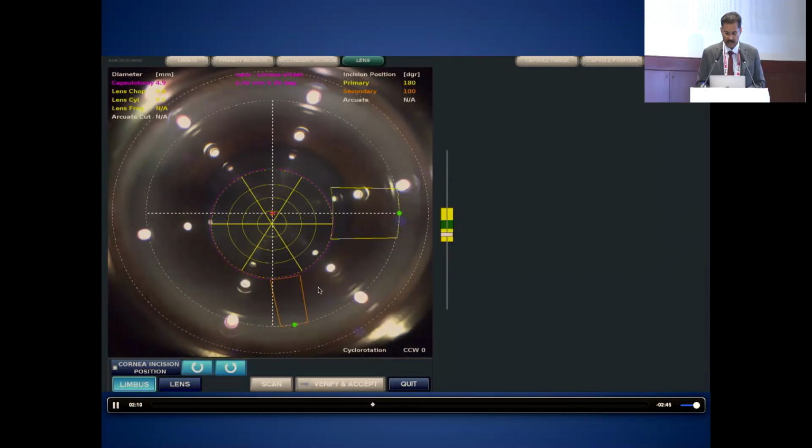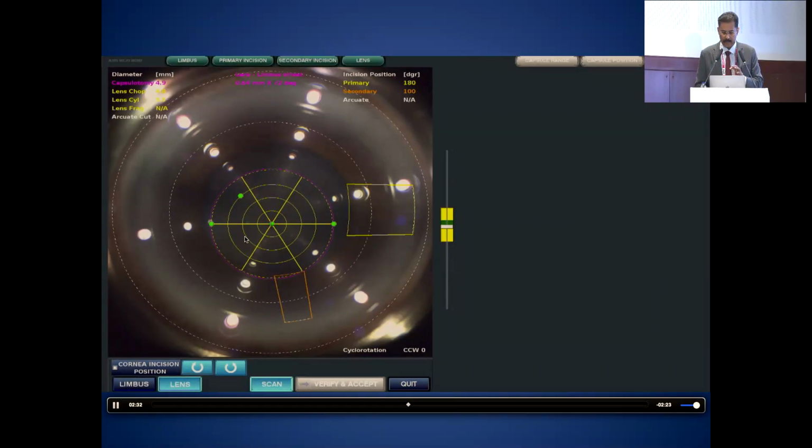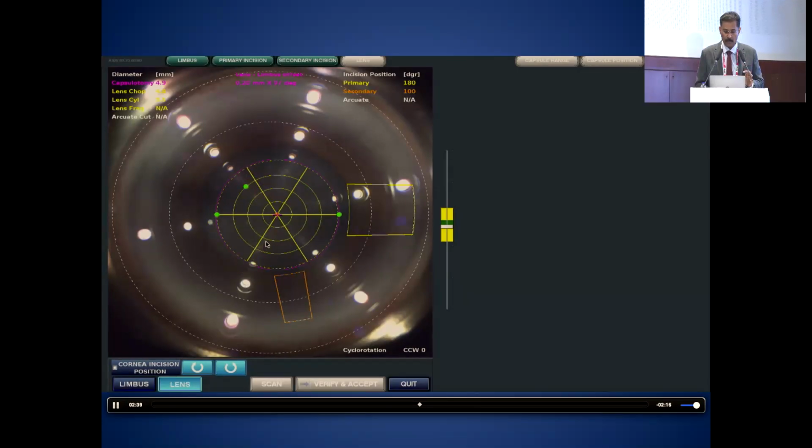the incisions also. Better be clear corneal because it doesn't go through hazy cornea, or large arcus, it doesn't cut, and towards the limbal area also it doesn't cut well, so be on the clear cornea. According to the pupil size, you can adjust the location of your rhexis, but once it has captured the limbus margin, it centers by itself. And if the pupil is decentered, let the rhexis be there. But if the pupil is too small and it is going to cut through the iris, then we have to manually change the location of the rhexis margin.